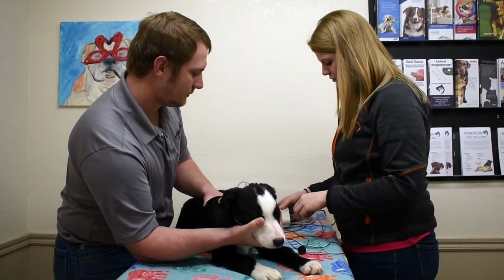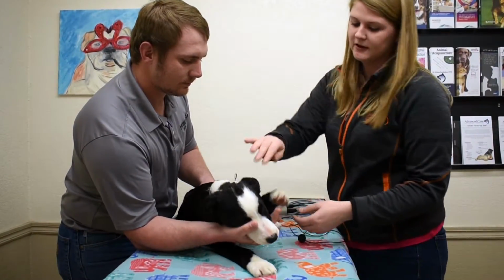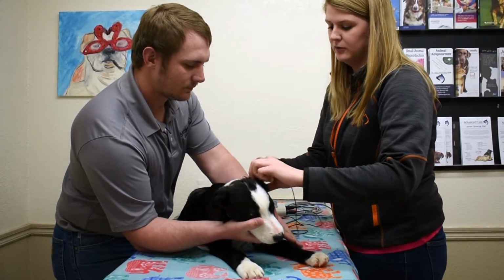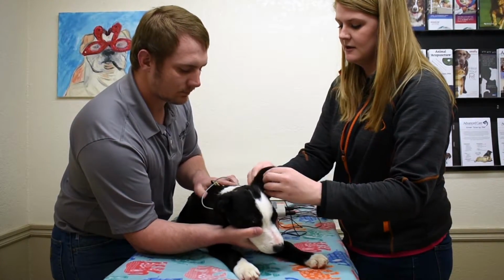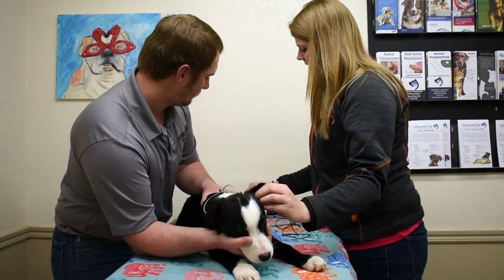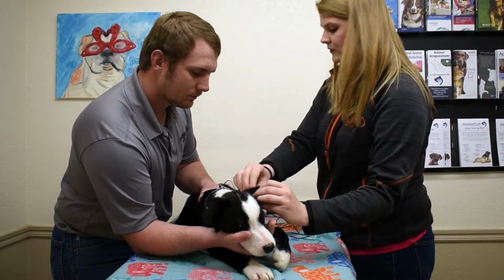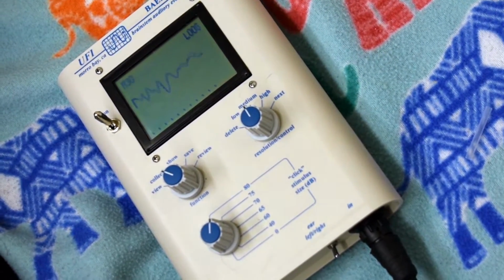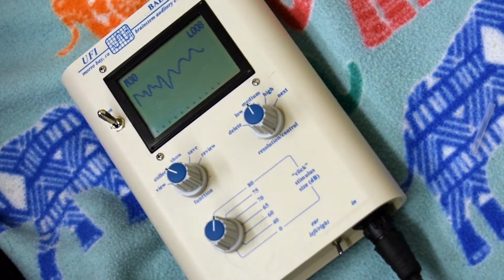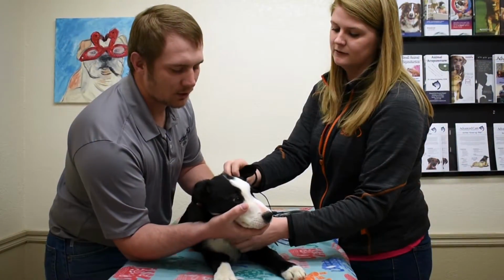So all we have to do is put the earpiece in. I know honey, I know, good boy. So this is on the left side. I've got a little switch here. I'm going to turn it to the left. And then we're going to start collecting data. So there's a little sound that he hears, and you probably saw him move a little bit. So he definitely can hear on that side just from noticing that response. But we're also going to get a little wave measurement just to show. Good boy, buddy.